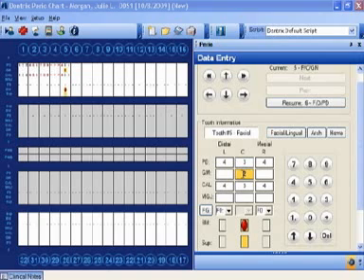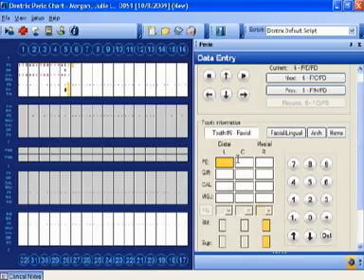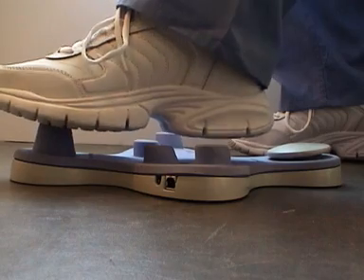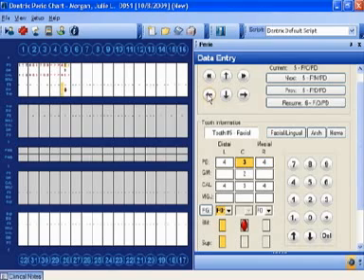Now with the G4, you have to mouse up to resume after you've done your recession. You have to mouse back up to resume and heel click, and that jumps back to your pocket depths. Now if you make a mistake, you can mouse up to your arrows up here and heel click, and they'll back you up. And then you can change your number to whatever you need it to do, or you can mouse forward. So it allows you to mouse around and change things and re-enter your numbers.